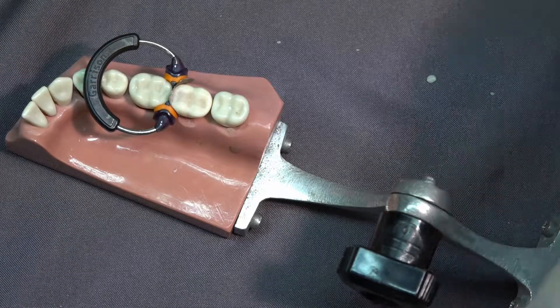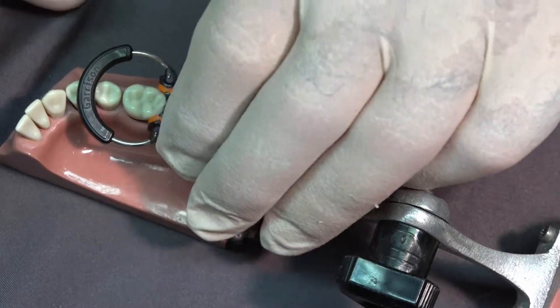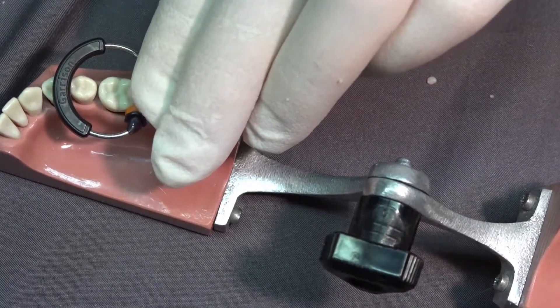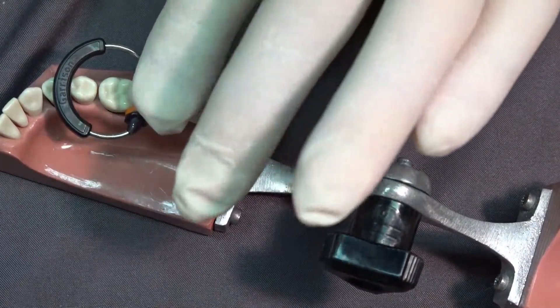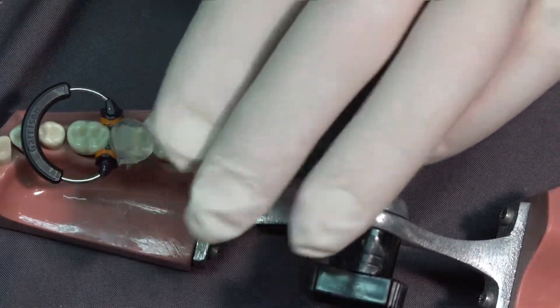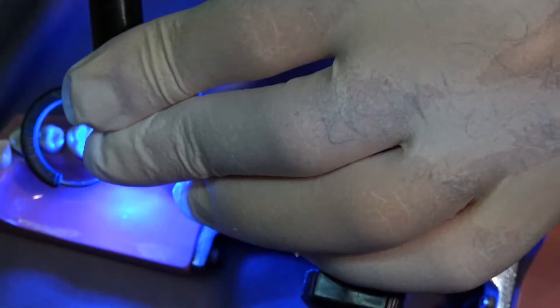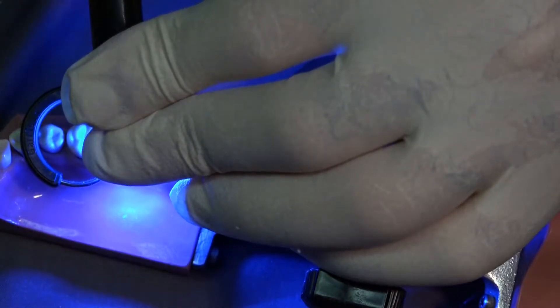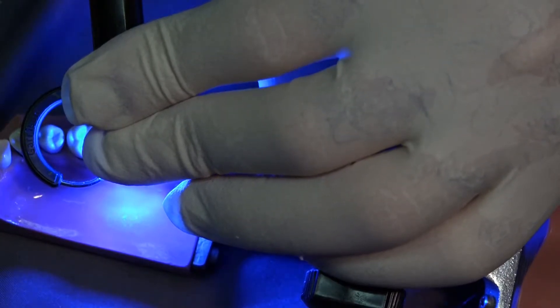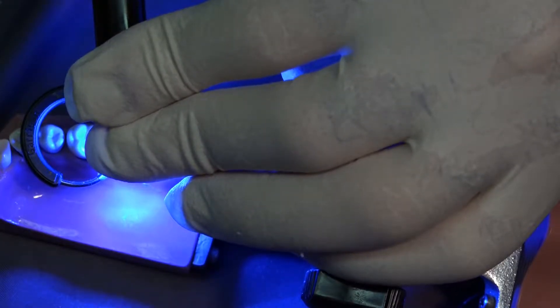Now I've removed all the flash. I'm going to take my custom matrix again, put it back on the tooth, and apply about five pounds of pressure with my finger for five to ten seconds. Then I'm going to put pressure on it as I cure through it, curing in the original shape, contour, and occlusion that this patient was familiar with when he or she walked in the door.